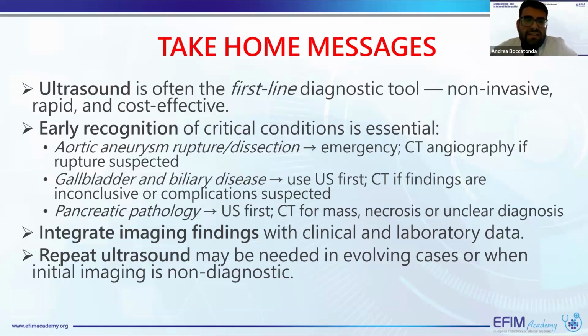In particular, ultrasound is the first-line diagnostic tool in almost all diseases and clinical situations, but we should remember that in specific situations, like a patient in shock with a suspicion of aortic aneurysm rupture or dissection, the CT scan is mandatory in the early phase of the management of the patient.